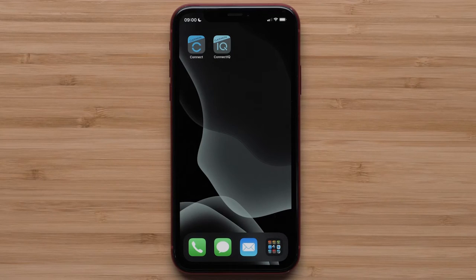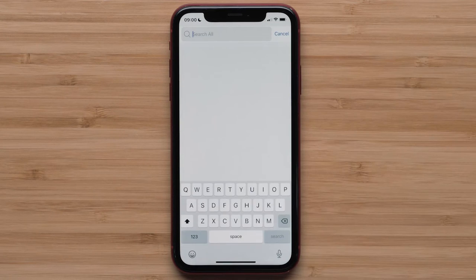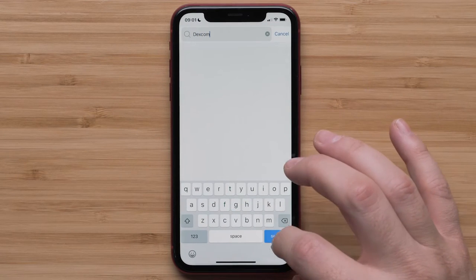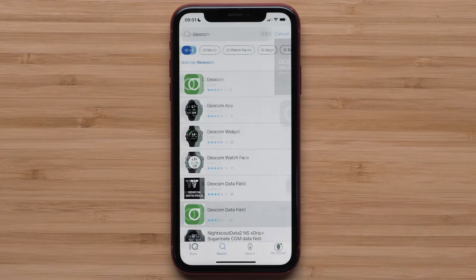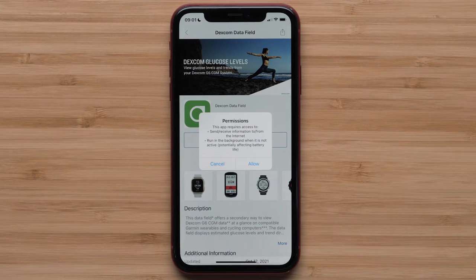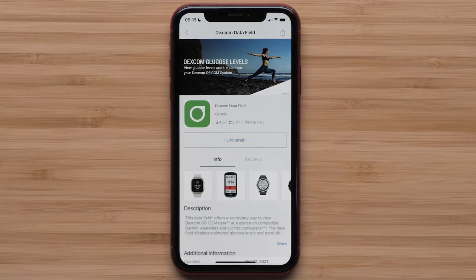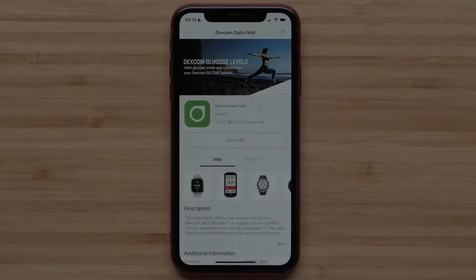Start by opening the Connect IQ app on your smartphone and search for Dexcom. Select Dexcom data field from the list. Touch Install, then agree to the app permissions to continue. Once the data field has installed on your watch, you can customize your activity profile and add the data field.